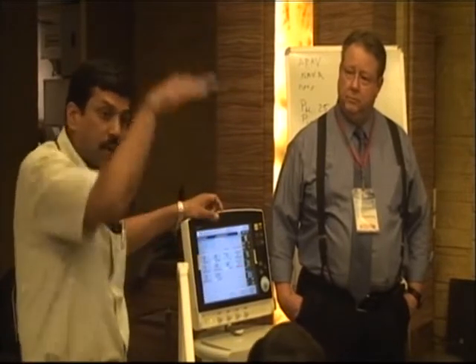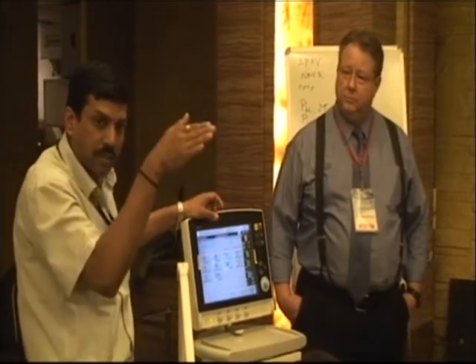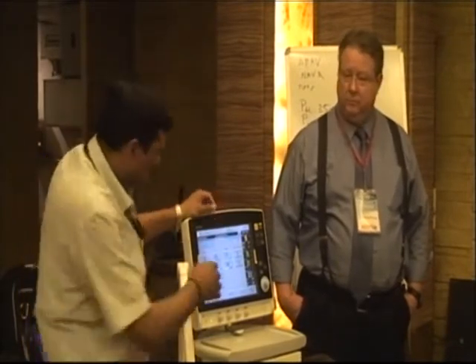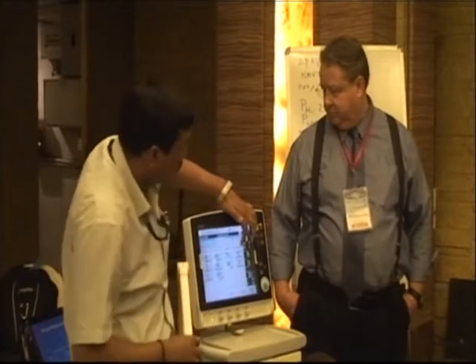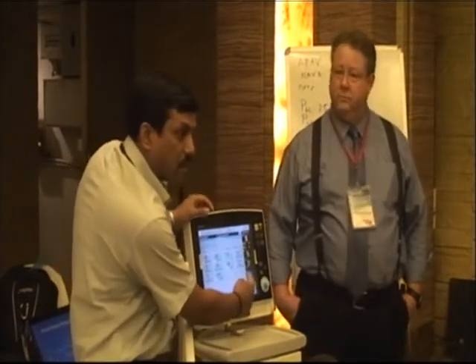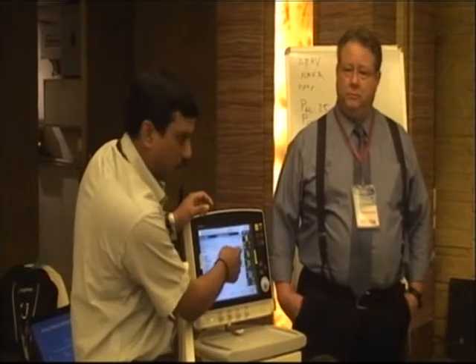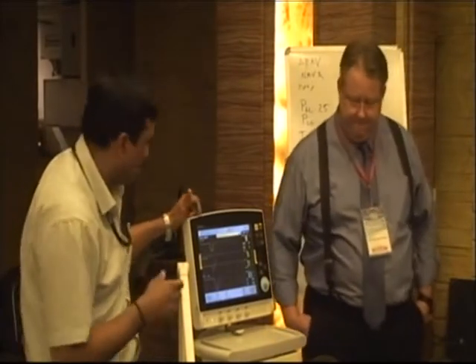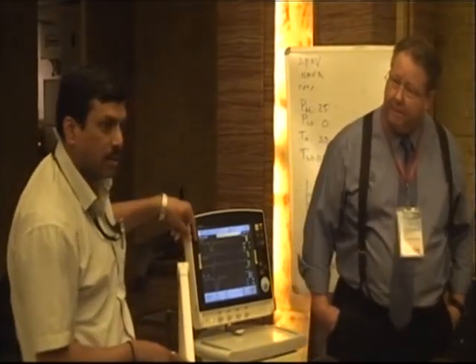When the patient is breathing spontaneously, the flow drops to a certain percentage. The machine cuts off the inspiration and allows the patient to exhale. So we have an inspiratory cycle, and we can support the patient at both the CPAP levels, the P high as well as the lower CPAP. We have added a threshold cycle. When the patient is not taking active inspiration, the machine will act as a control ventilation.